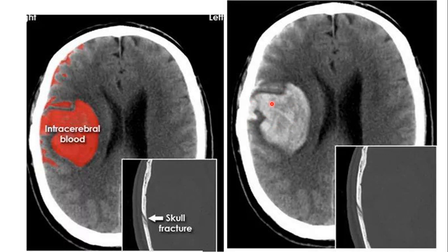There is subarachnoid bleeding in this case. When we apply the bone window and magnify, we can see a fracture here, which most likely injured an artery over the surface of the brain. So there is subarachnoid bleeding in addition to the intraparenchymal hematoma.